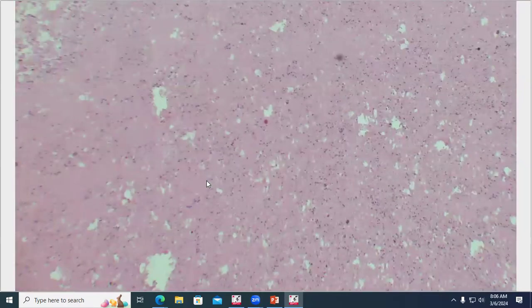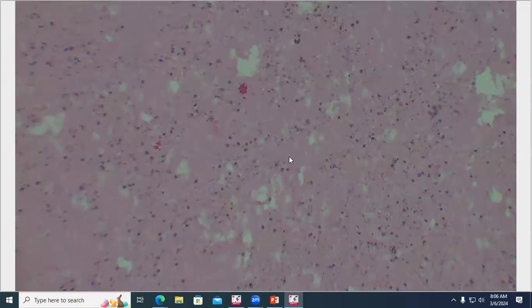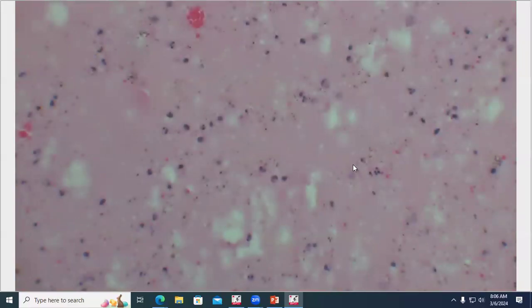When we look at all that stuff that was in the ocular chambers, oh man, it's so dark. It's basically a mix of eosinophilic proteinaceous material, some red blood cells, and then a lot of other cells that are macrophages with stuff in their tummies, and also probably some neutrophils, and possibly also some sloughed neoplastic cells, but it's basically impossible to really say that with confidence.